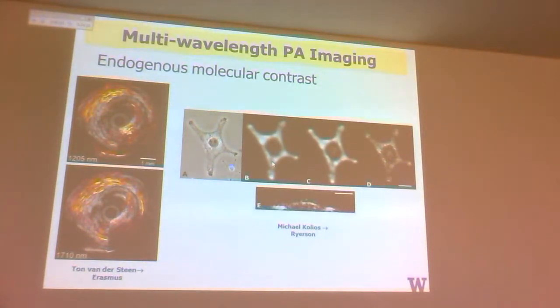If you only want to do photoacoustic imaging, it relaxes some of the technical constraints on the transducers, whereas when you want to do full pulse echo imaging, it's tougher technically. So for example, on transducers, if you just receive, you don't have to worry about managing high voltage pulses, and so you can get higher densities. There are lots of those kinds of trade-offs in there.